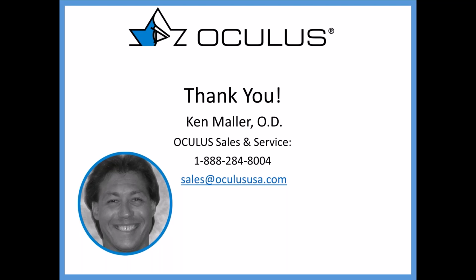And in the course of, what was it, 3 visits, I had her in a multifocal doing great for the entire day. So it absolutely decreases the amount of remakes. Remember, I did not in any of these 3 cases use any diagnostic lenses. Basically, the very first lens that I put on was my diagnostic lens. And as you saw, for the most part, I had the fit nailed down on that first lens.